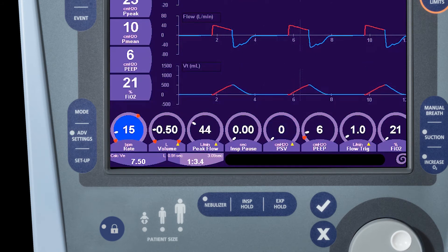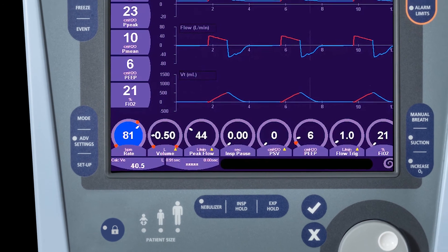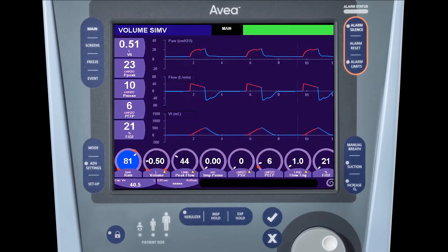If you're adjusting a control and you notice that you pass a red indicator on that display, that indicates that you've passed an associated alarm threshold. If you do this and accept the setting, it will result in an immediate alarm. Under these circumstances, you should first change the alarm threshold and then change the setting.